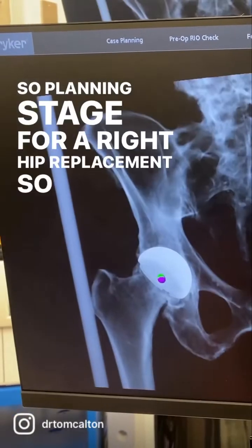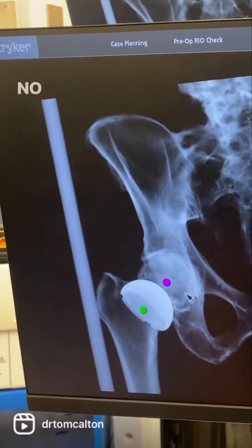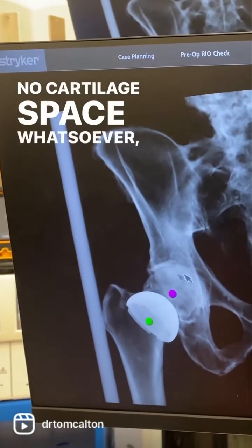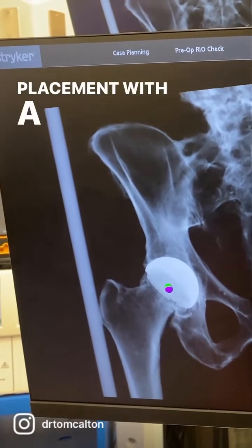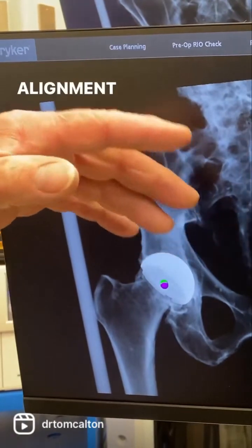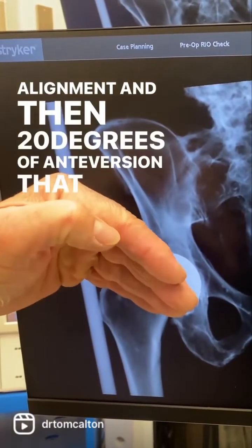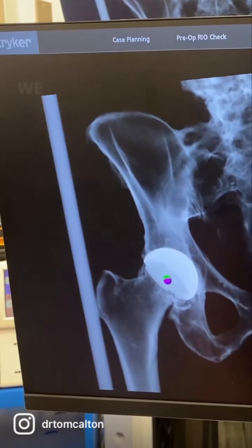Planning stage for a right hip replacement. Here's the x-ray. This is where the cup is going to go. No cartilage space whatsoever, so we've designed this cup placement with a 42-degree angle in an abduction alignment, and then 20 degrees of antiversion. That protects from dislocating out the back, and that is a really good position to start with.